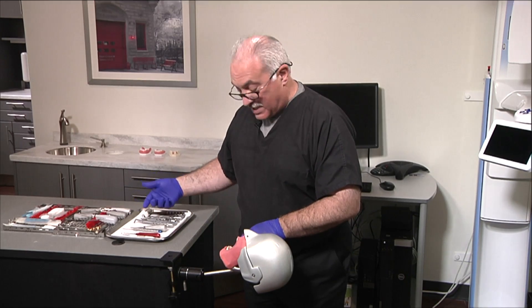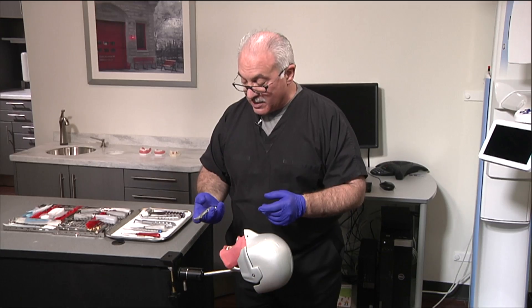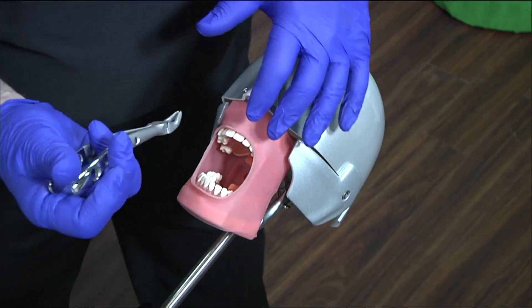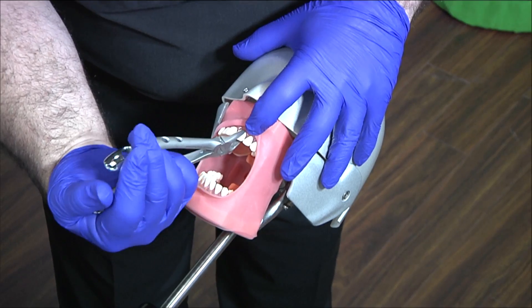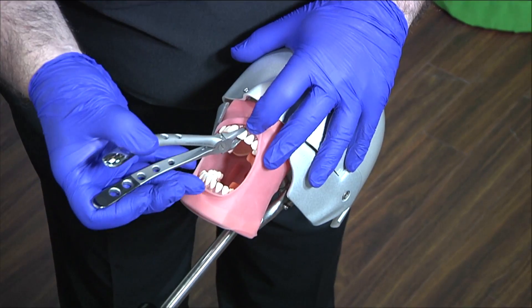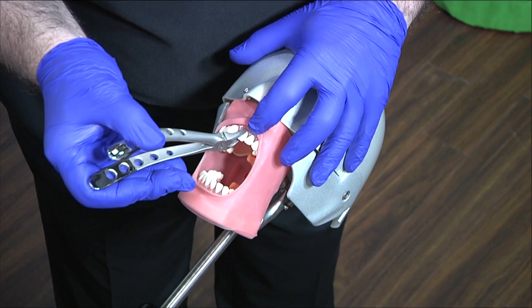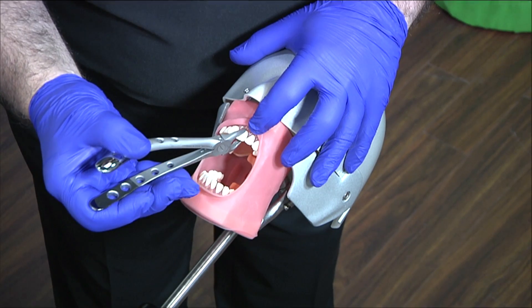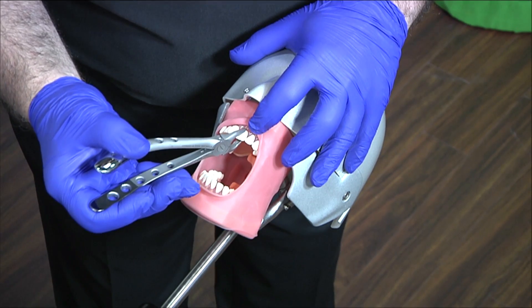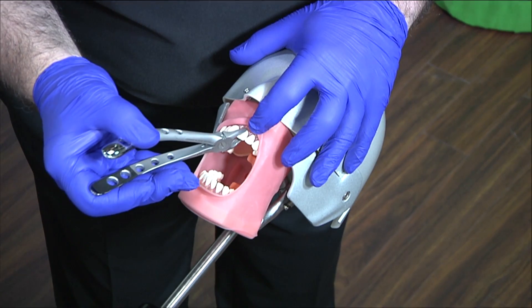The next instrument — what tooth am I taking out? Let's say it's tooth number nine again. I tend to have the patient tip their head and the forcep is like this. I'm holding it with my fingers and my thumb, and I literally will unscrew the tooth right and left — clockwise, counterclockwise, lefty-loosey, righty-tighty.